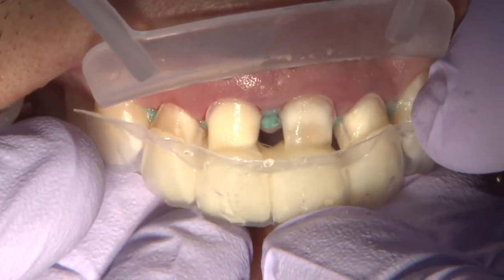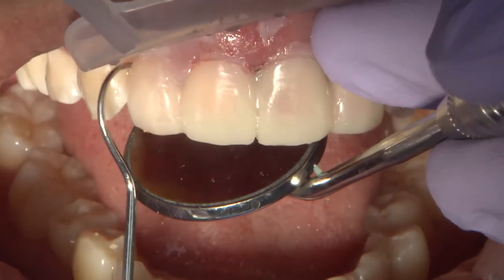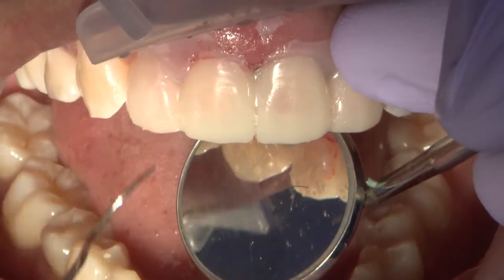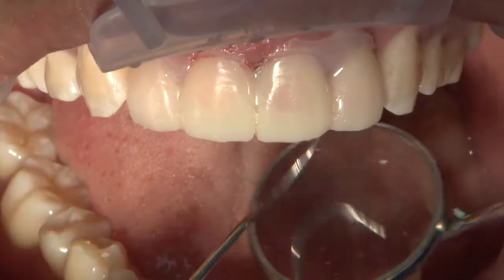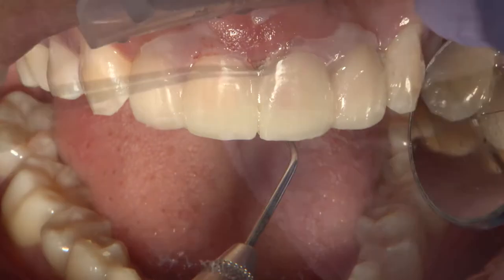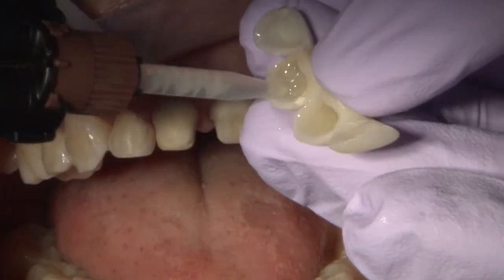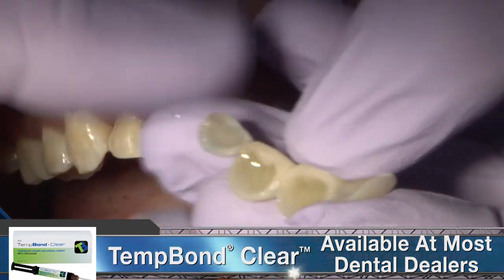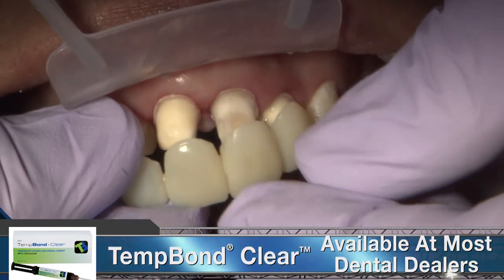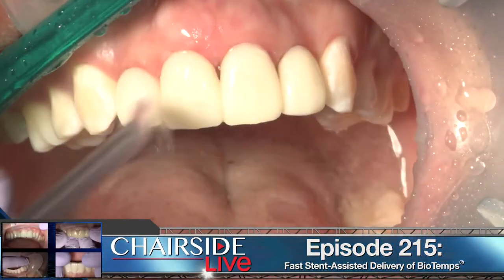Here you can see my assistant using Opal Dam Green to block out the interproximal undercuts that could cause relined material to flow and lock the temporary into place. After a quick light cure of the liquid dam, the Fast Stent-assisted BioTemp can be relined and cured in place. For this combination case of two crowns and two veneers, TempBond Clear was chosen for the temporary cementation.